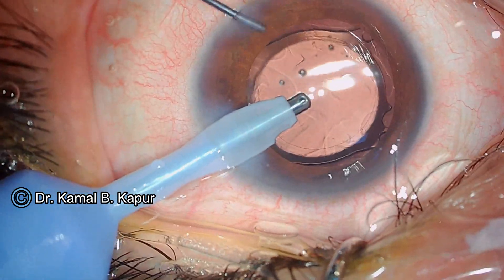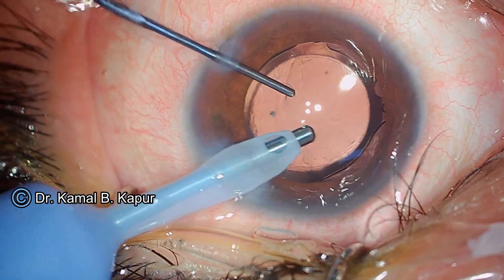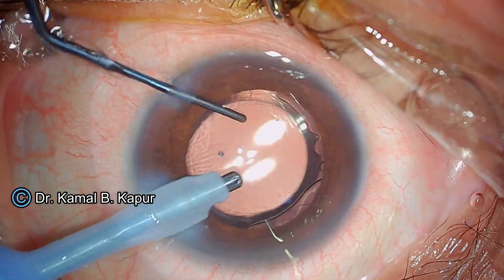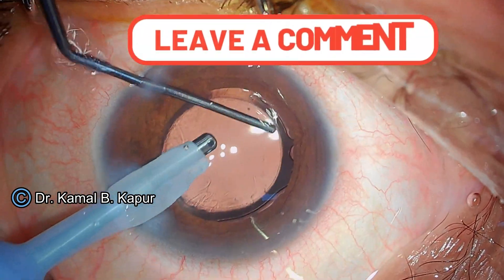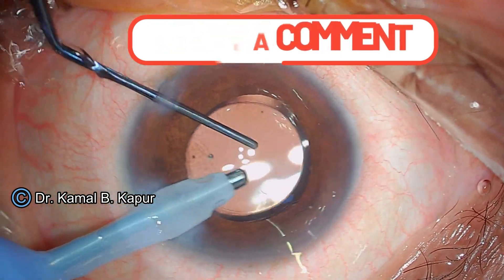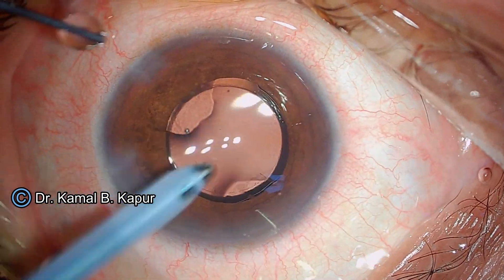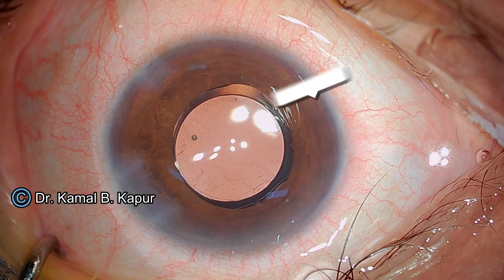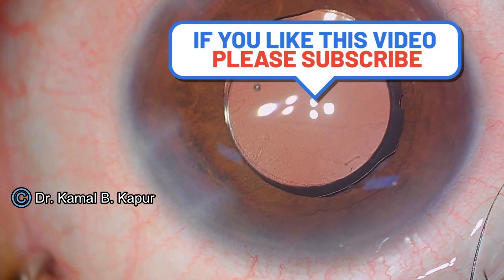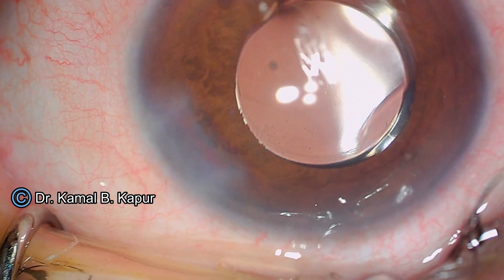The trailing loops go into the bag and the lens is well positioned inside. It is a very stable lens with four haptics. We perform viscoelastic removal. One thing to notice is that there are no separate zones visible in the central part of the optic — the anterior surface is absolutely smooth without any raised bumps or minuscule rings, unlike some other lenses available in the market. As a result, there is no loss of contrast and no incidental halos or glare.